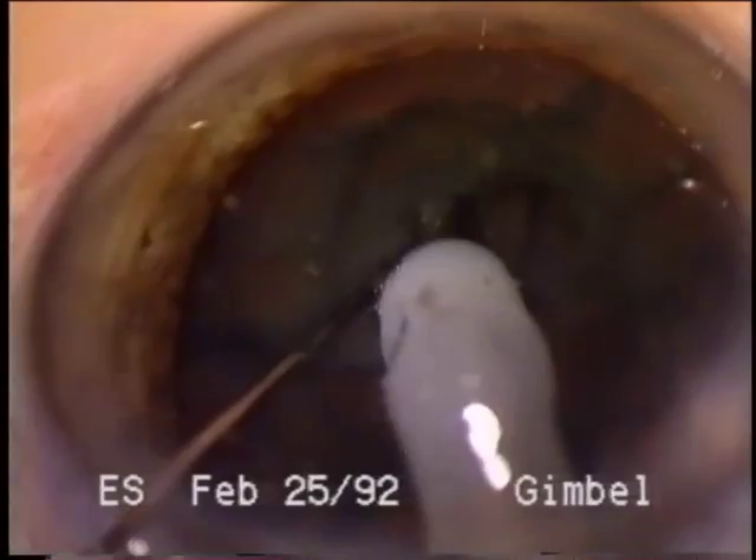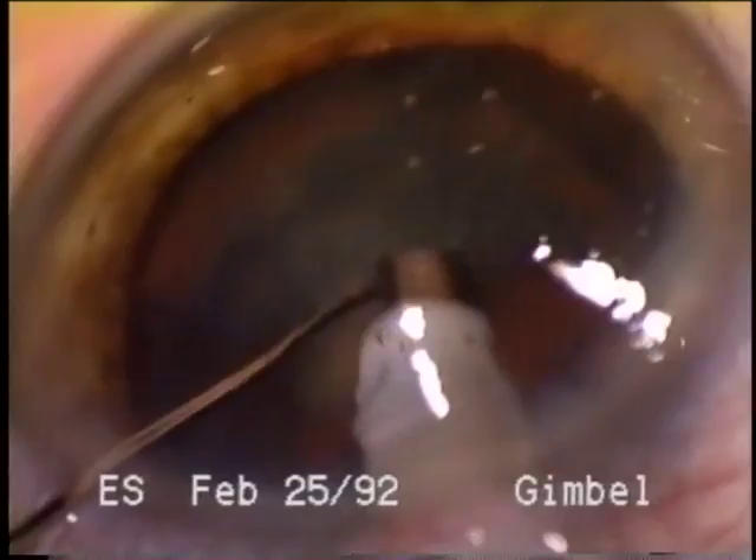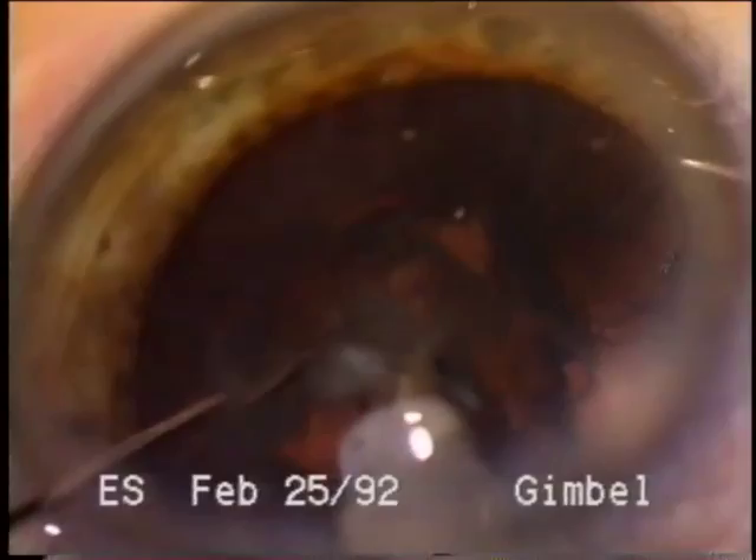There are cases, however, where hydrodissection cannot be used, and for these reasons, I would like to present a method of manually dissecting the capsule from the cortex, which we have termed hydro-free dissection. The principle of manually dissecting is not new.